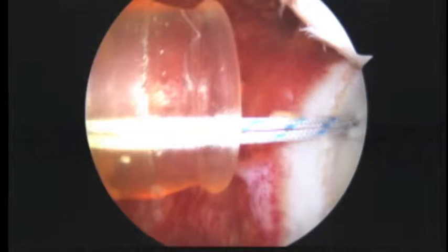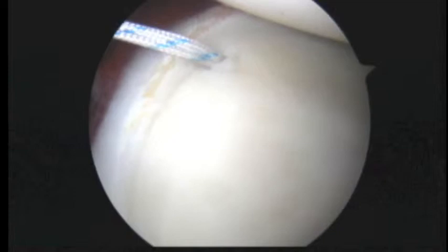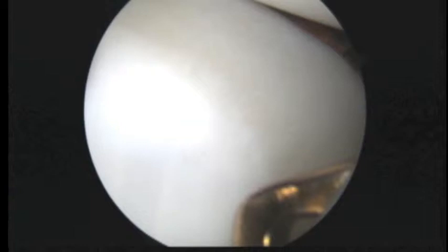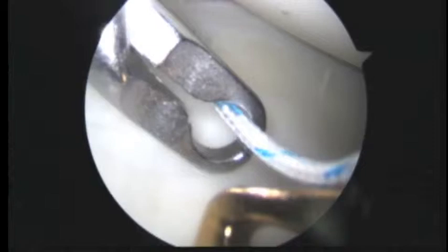We'll pull back just a shade and see if we can see this anterior cannula, which is way superior here. We're going to reach in and pass one of the sutures to the front — see how we use two hands to just basically hand it off to ourselves.